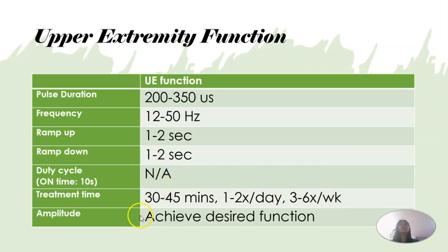But, kayo bahala, if you would want it timed, yung upper extremity electrical stimulation, or i-base niyo siya dun sa repetitions ng grab and release or whatever activity na papagawa niyo kay patient. Pwede din yun. Okay, sa amplitude, achieve the desired function.